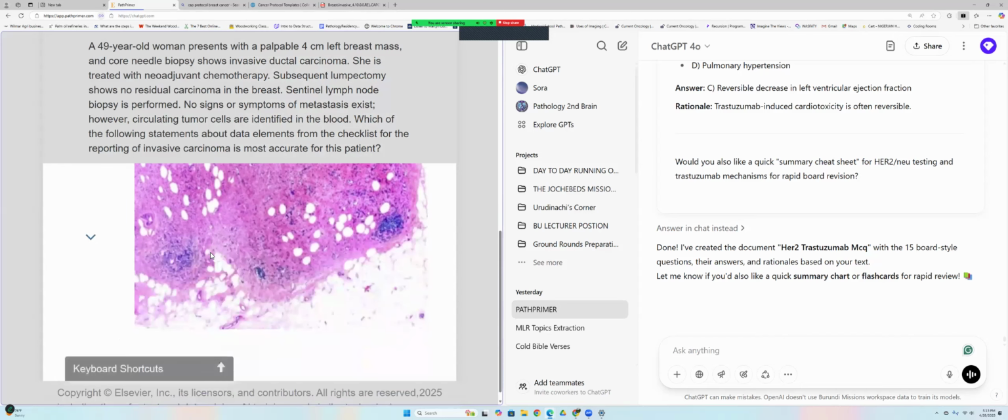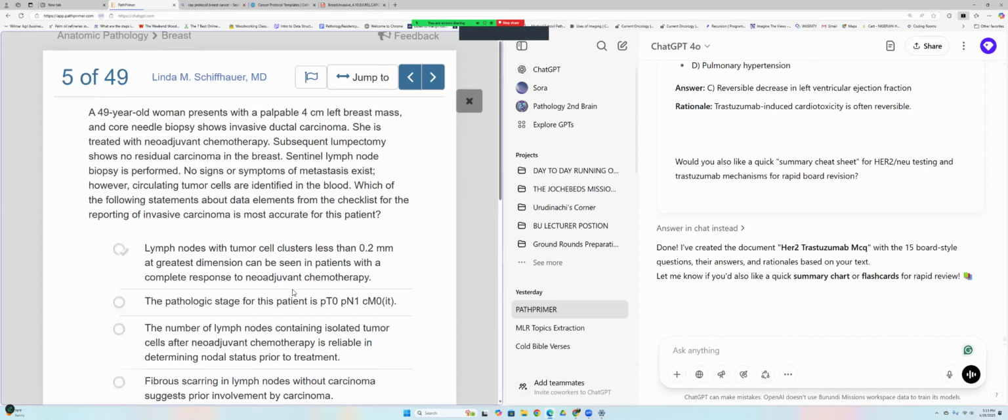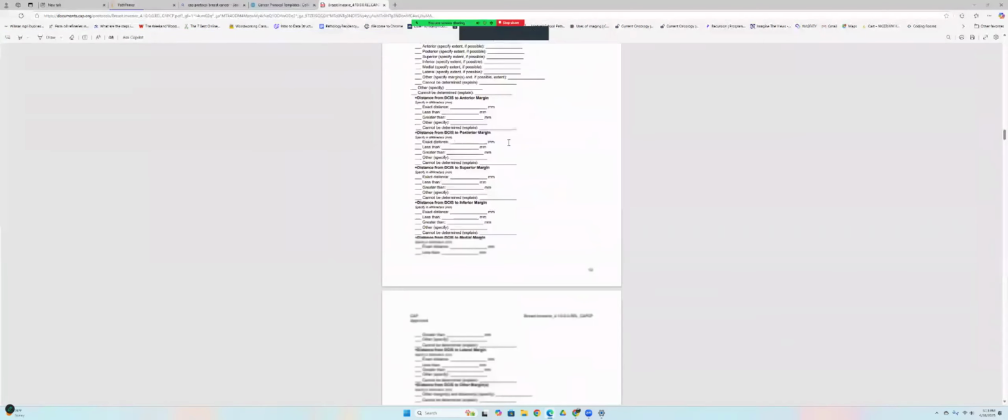I can't remember. Okay, so let's quickly look at the CAP protocol. I said D.